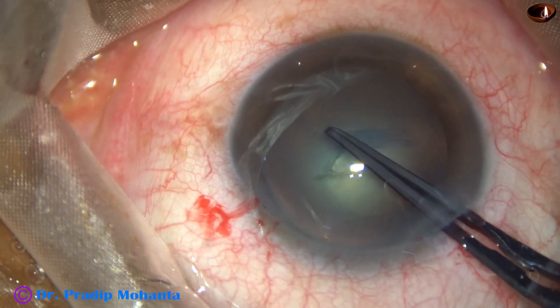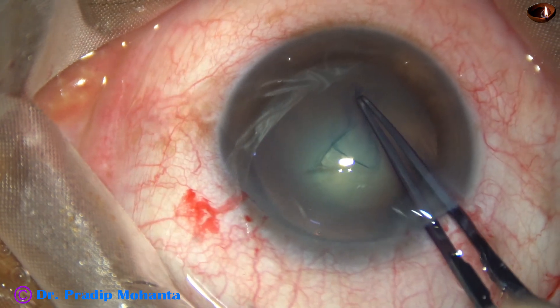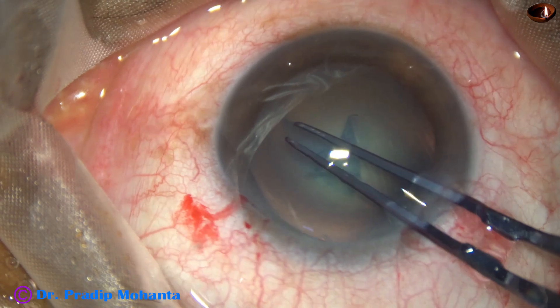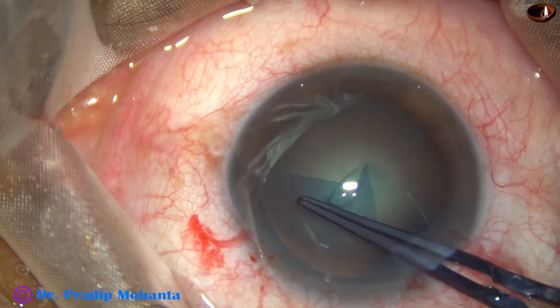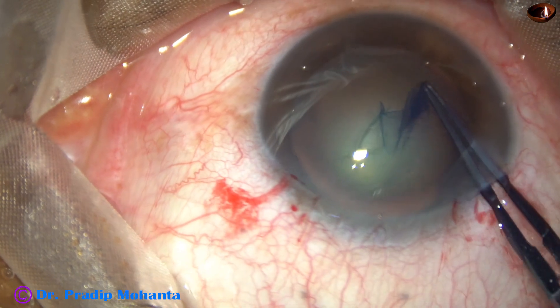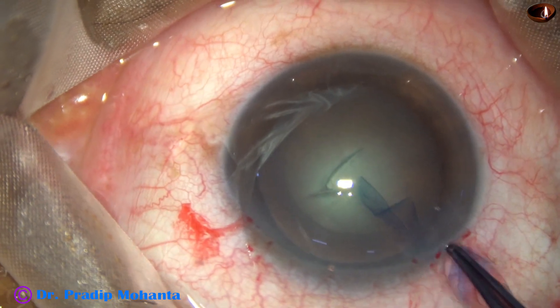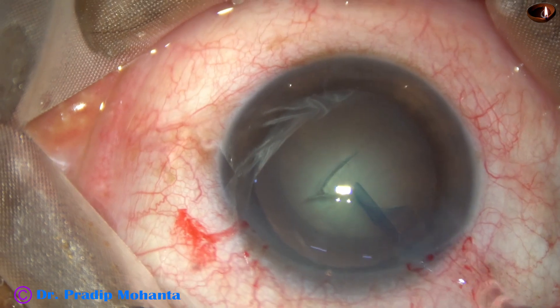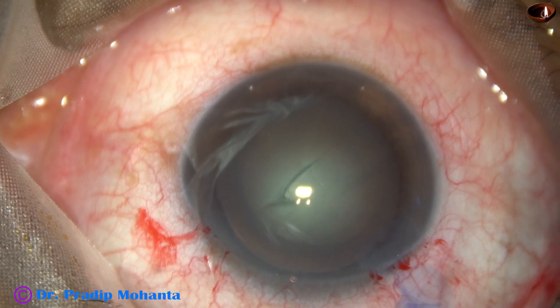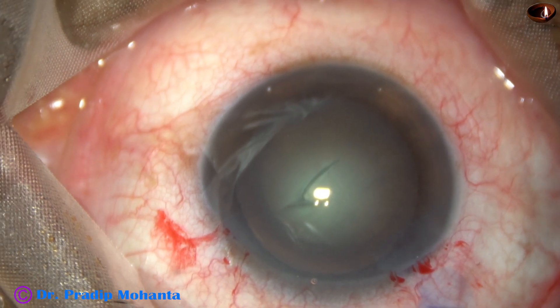The anterior lip of the main wound is lifted up. If a lot of viscoelastic comes out, we have to use viscoelastic again to maintain the anterior chamber. A nice capsulorhexis of about 5.25 millimeters is done.